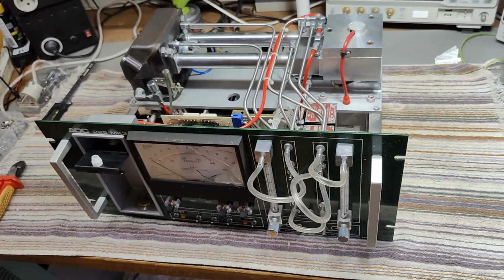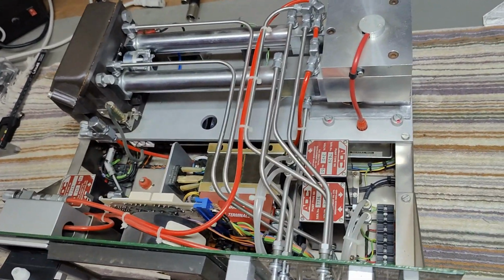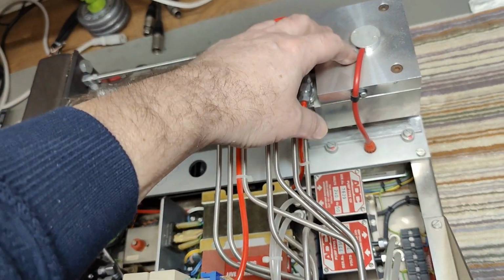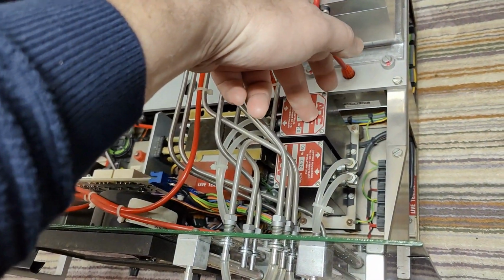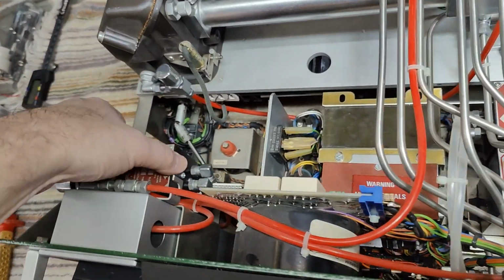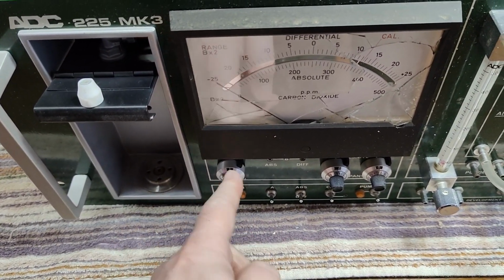This one is getting more and more interesting to have a look at. We got all sorts of fancy thingies in here. I'm actually a little bit out of my league here, but we got definitely a little pump. So something is getting pumped around here, and this is the sensor unit. It's written here on the unit, and we got pumps. See, and they are mounted on a little flexible plate, so we don't have any vibrations. And there's another pump over here, really nicely mounted. Oh yeah, I thought this would have been a little potentiometer to do something electrically, but look at that.